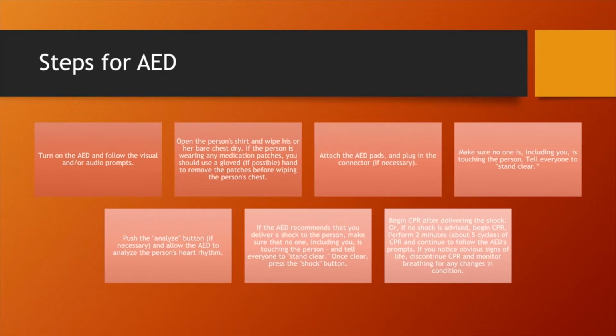The seventh step is to begin CPR after delivering the shocks. Or, if no shock is advised, begin CPR. Perform 2 minutes, about 5 cycles of CPR, and continue to follow the AED's prompts. If you notice obvious signs of life, discontinue CPR and monitor breathing for any changes in condition.